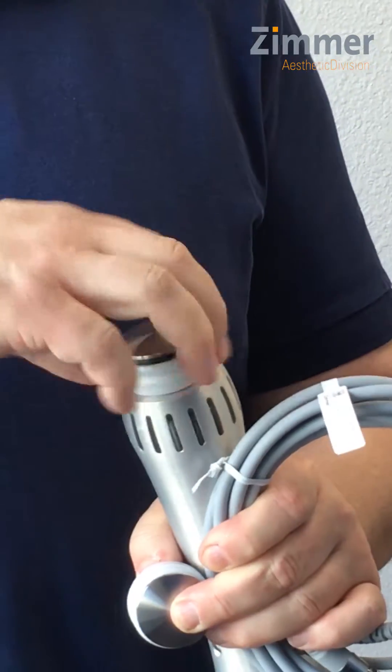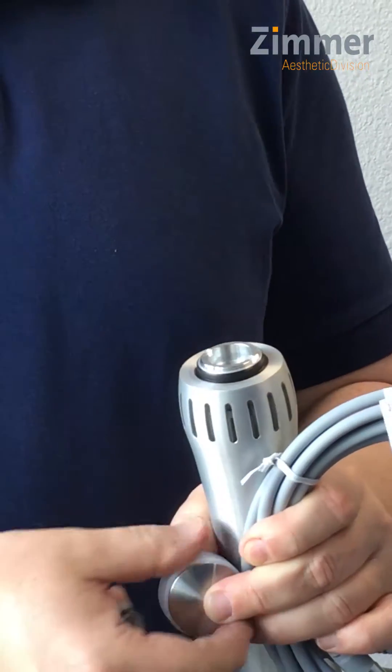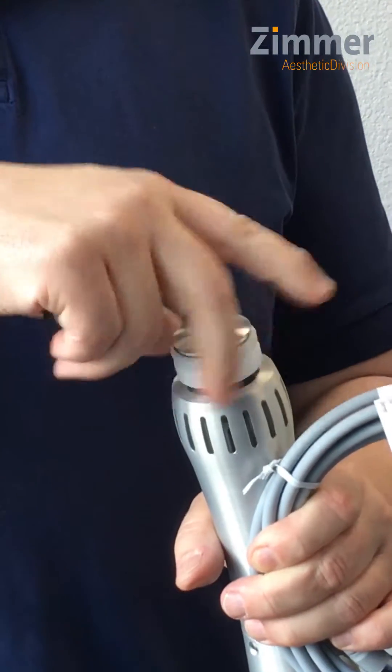All you have to do is unscrew the old applicator head and put a new one in.